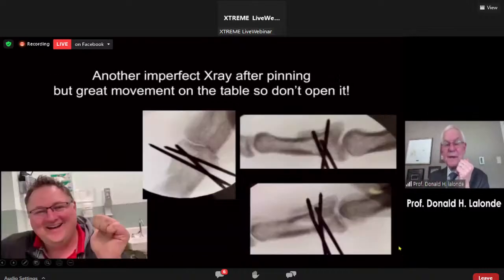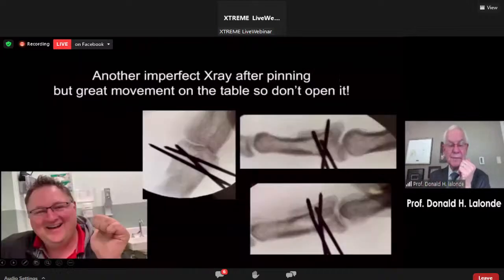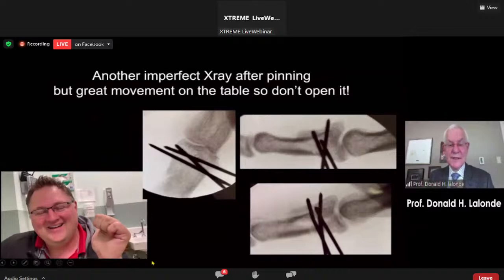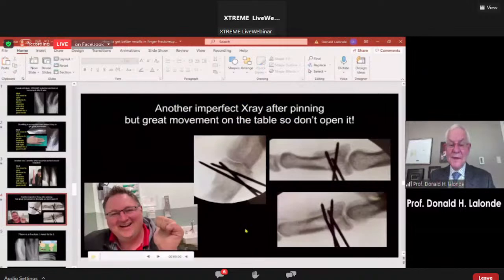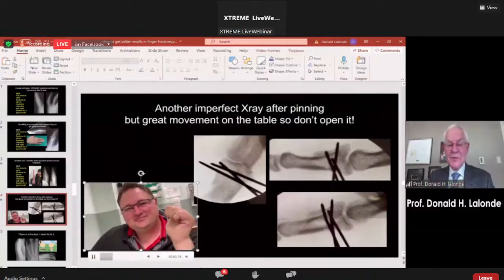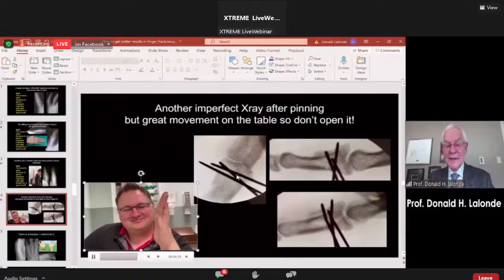Here's another one, not a perfect X-ray. I have to take it off full screen for just a second, guys. There we go, sorry. Look at the movement. He had great movement on the operating table, not a great X-ray, but there's his post-op movement.